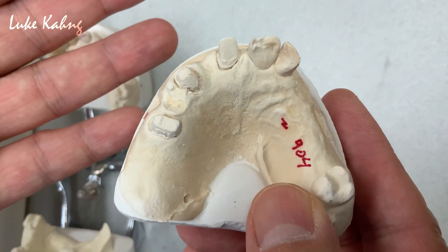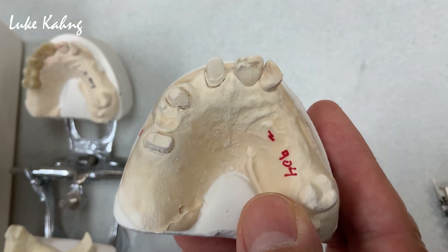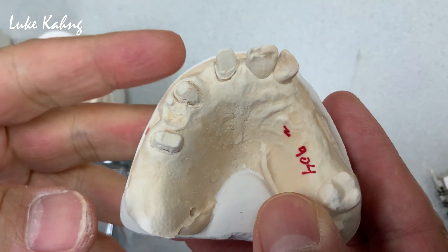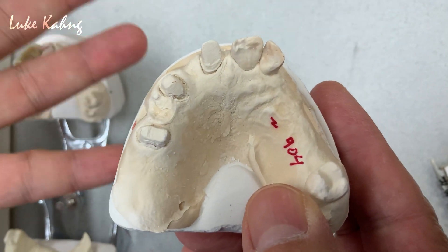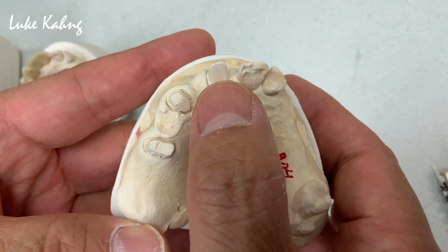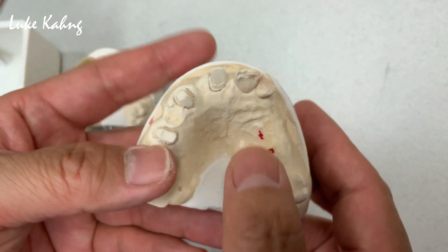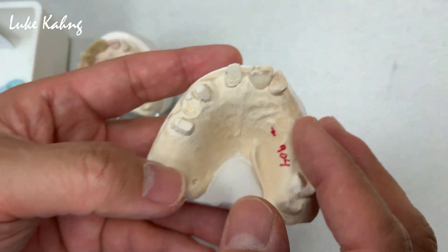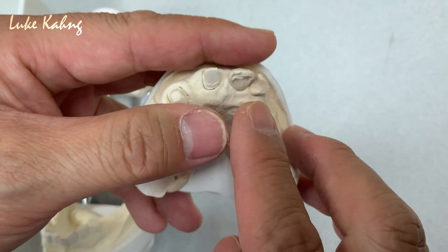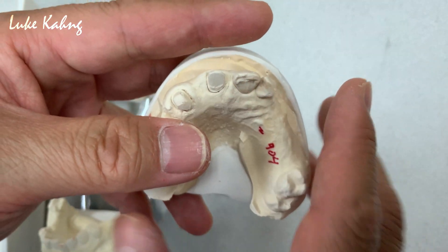There's an option for material selection from the lab: metal underneath, which we call porcelain fused to metal, or we can go to zirconia. Which one is better? I wish I could make the metal occlusion here, but the patient doesn't want to see any metal on the back side. So we have to choose zirconia, because I need some contact. Look at this — this patient already cracked it, so we have to protect it.